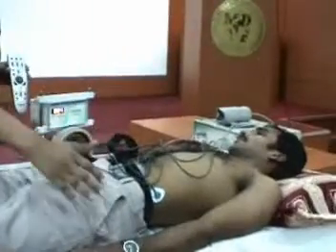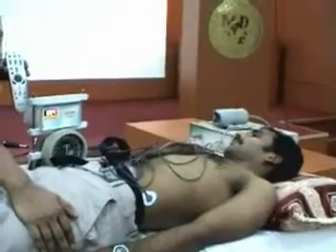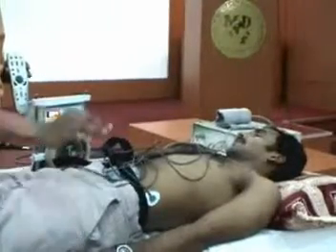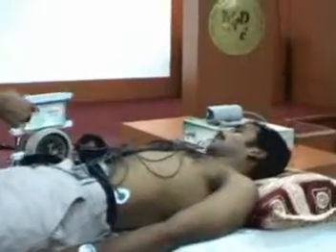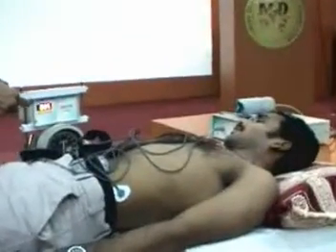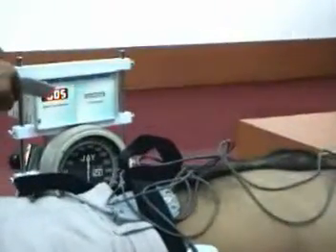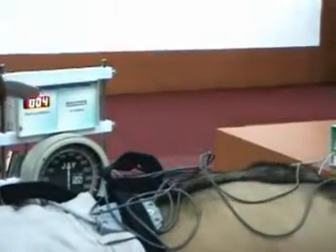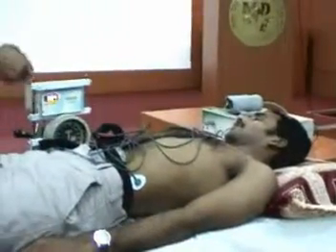Sir, your first test is over. Now we will go on to the second one, which will be testing your heart rate response to deep breathing. You have to carefully follow the instruction, and if you see in the prompt panel here, you will get a display of a red and a green color. When the red color comes, you have to take in a deep breath and hold it. When the green color comes, you have to leave the breath. Okay? Okay. Now we will perform the test.